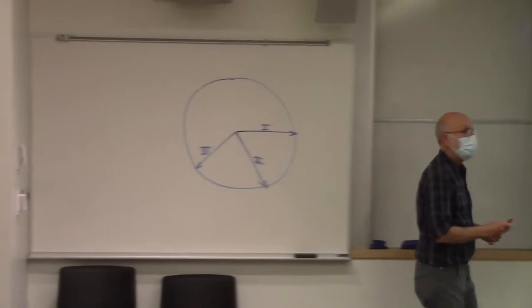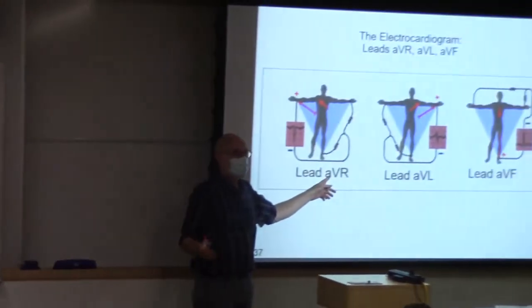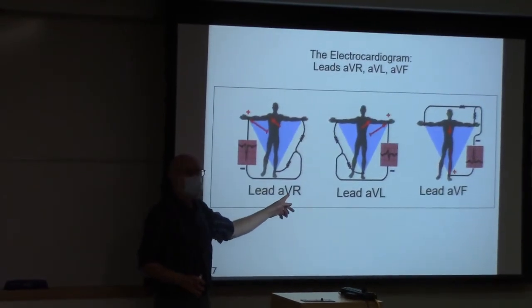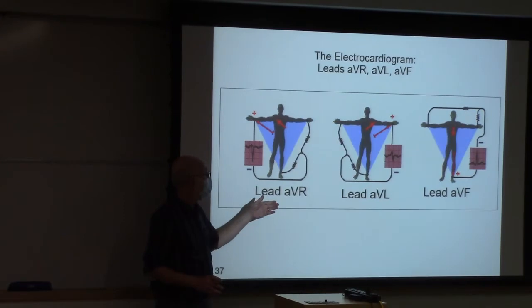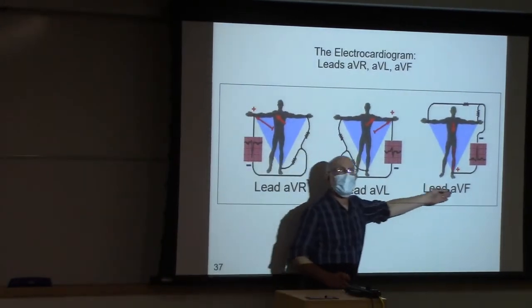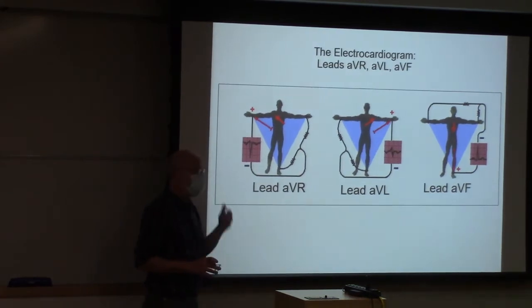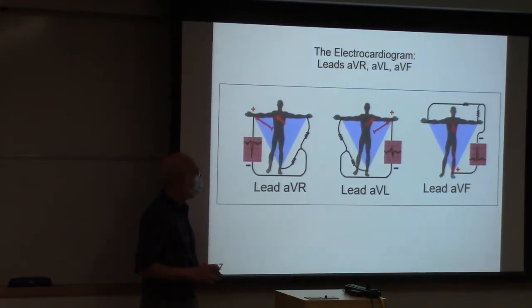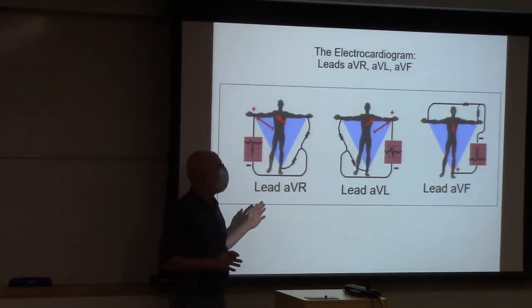So here are 3 more. A stands for augmented, I won't test you on that. V stands for ventricular, I won't test you on that. But I do want you to know AVR, AVL, AVF. The augmented leads, AVR, AVL, and AVF, do a funny thing with the electronics.